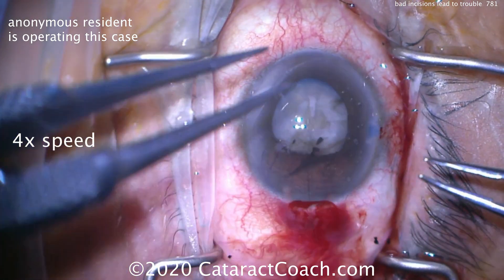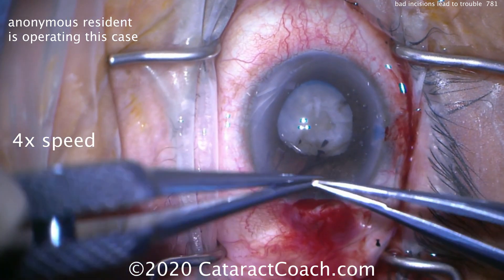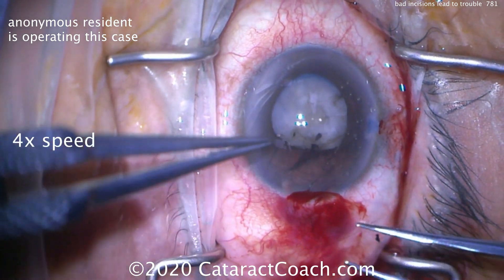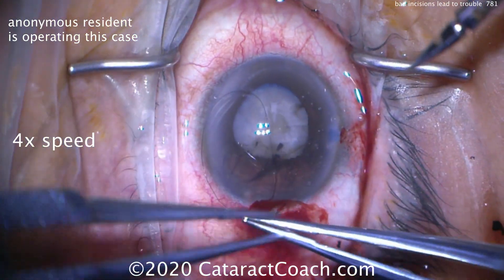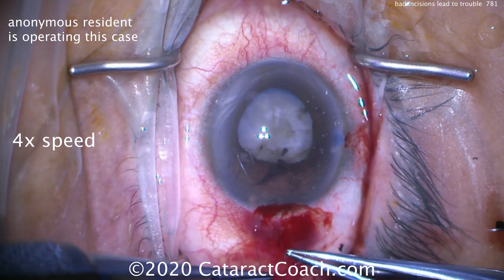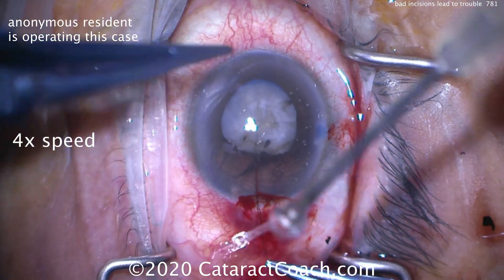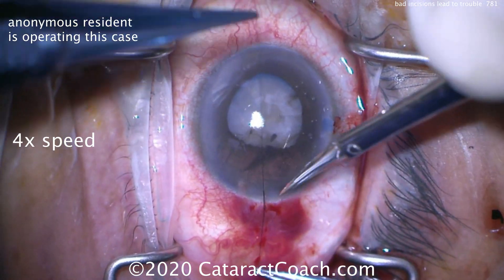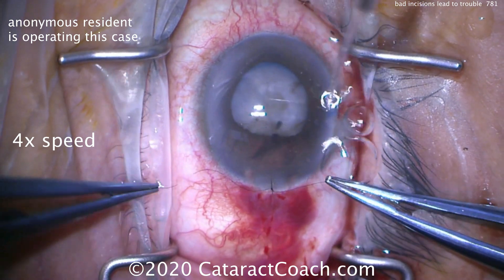That's a very important lesson. In cataract surgery, every step builds on the previous. A terrible incision means the whole case is going to suffer. So what you should do in a case like this: abandon that first incision. It's okay. Suture it up, close it completely, and then make a new incision.